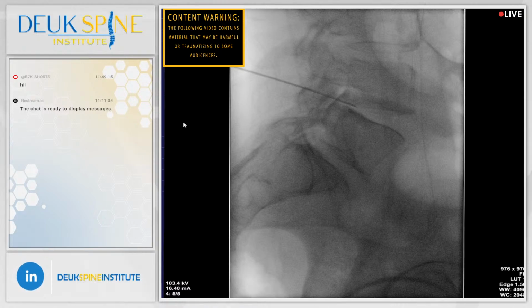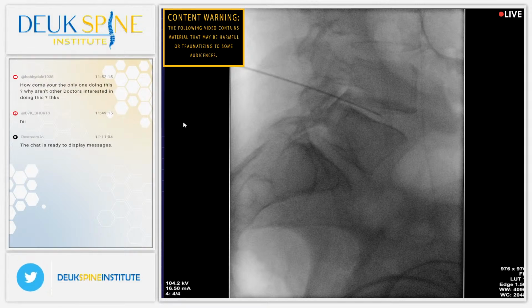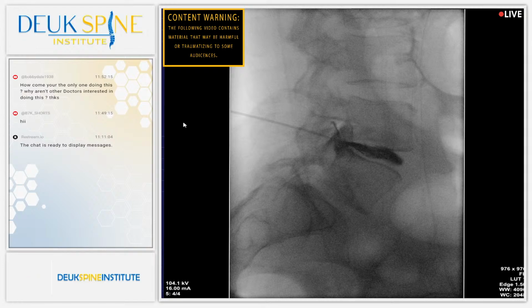All right, we're in. I think that's as good as we're going to get it there, Jordan. How you doing, my friend? You okay? Open your eyes for me. Good. Can you open your eyes for me? All right, that's fine, Dr. Berndes. Yeah, I think I'm happy with where we are here.